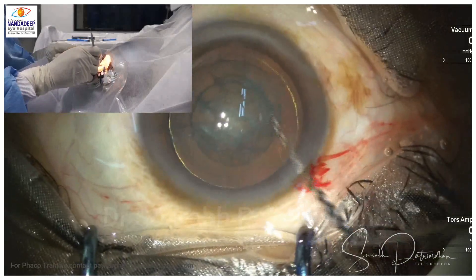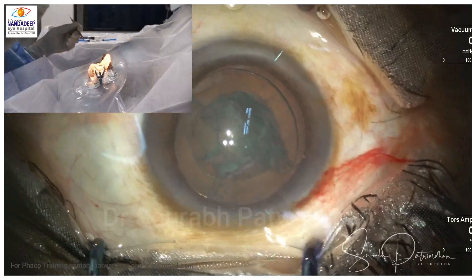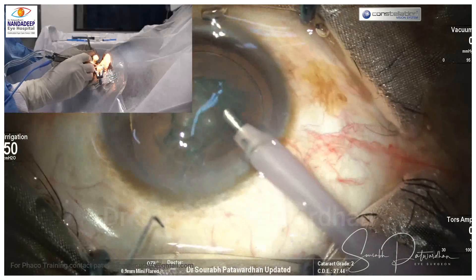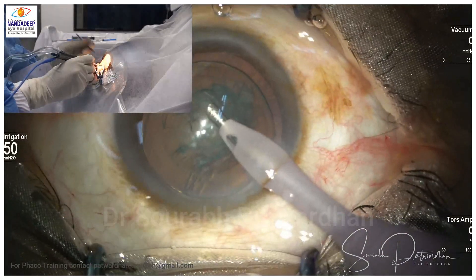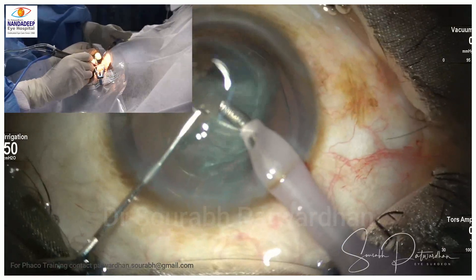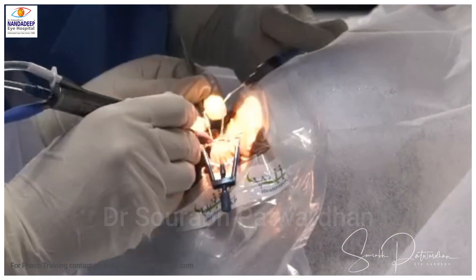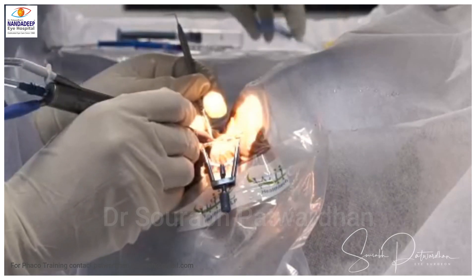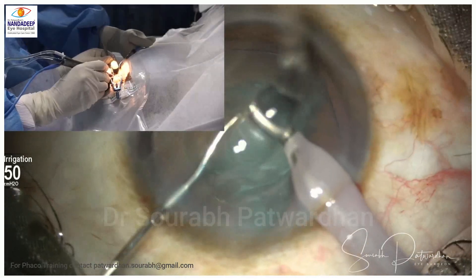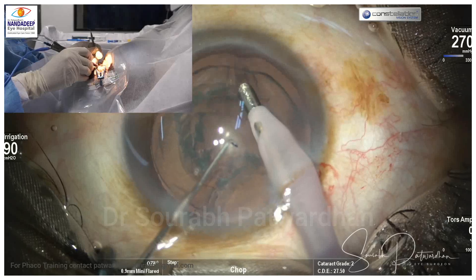For nucleus rotation we use the up approach because we want to maintain the anterior chamber. Now whenever we are negotiating the side port incision, always remember the hand position starts below the eye a little bit and then goes above — this is how small side port incisions can be negotiated when entering using a Sinskey hook. Many times you struggle if you go directly straight. Go a little bit down when entering and then tent it up to avoid fluid leaking out.